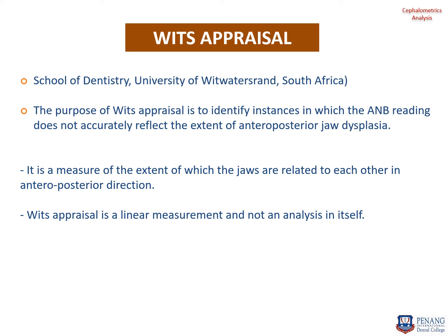However, Wits appraisal provides a measure of the extent to which the jaws are related to each other in the anterior-posterior direction, and also Wits appraisal is a linear measurement and it's not any particular or specific analysis in itself.